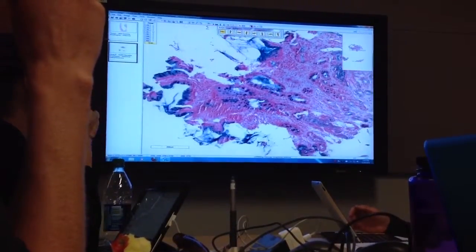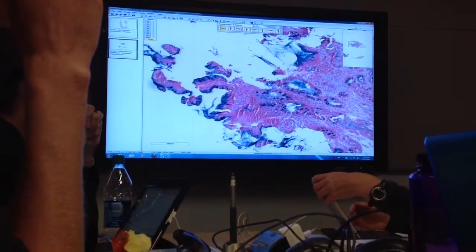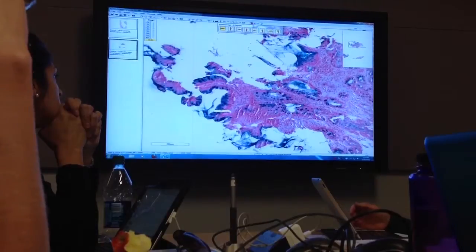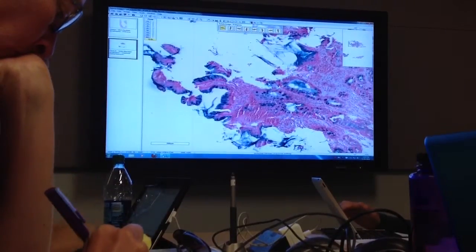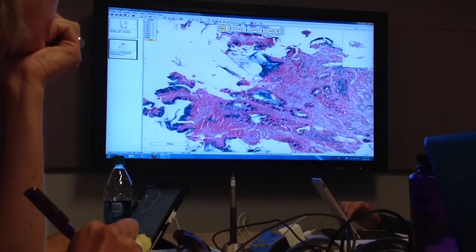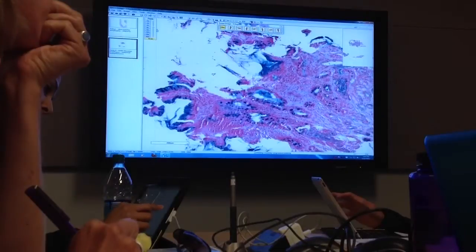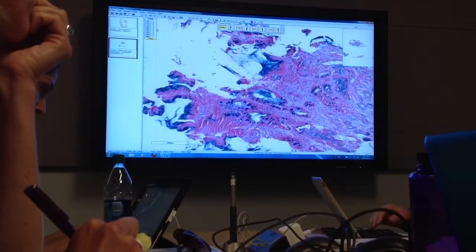Esophagus, right? So it's kind of hard. And here's the surface epithelium. Here's almost a finger-like villus. It's got this little villus formation on the surface. And then you've got all of this epithelium. It's got these little blue, round, mucin-filled blobs.